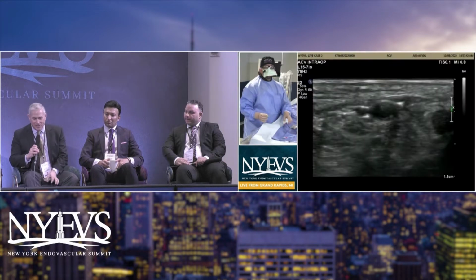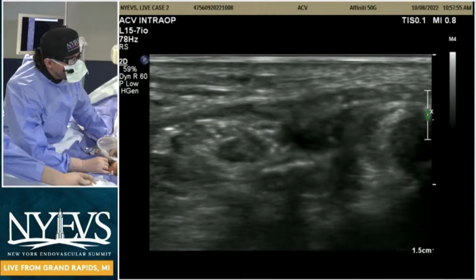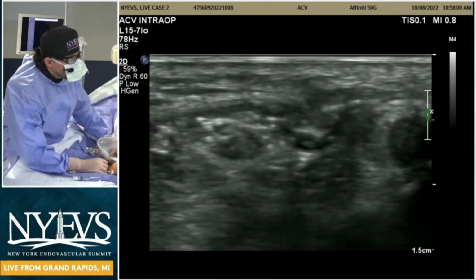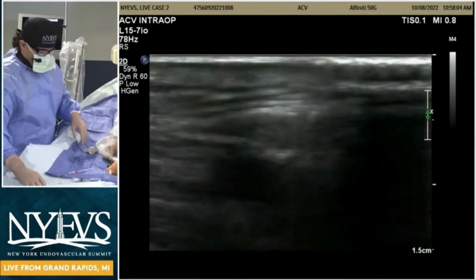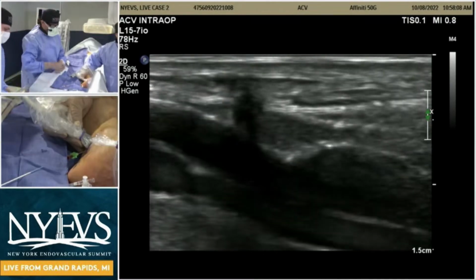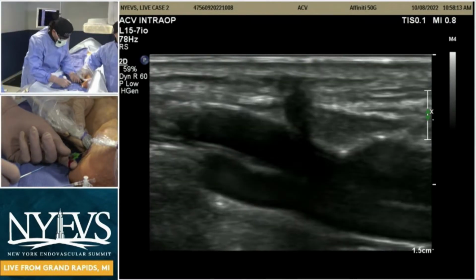Yeah, it's a great case. Can you guys show the ultrasound? And there should be a lot of discussion about this. I think that I would also take an endovascular approach to this case, first of all. Patients already had bypass. It would be redo to do any surgery. It's relatively focal lesions in those proximal tibials that you could go after, and so I would definitely do that. Now, I think the question is going to come in access and approach.